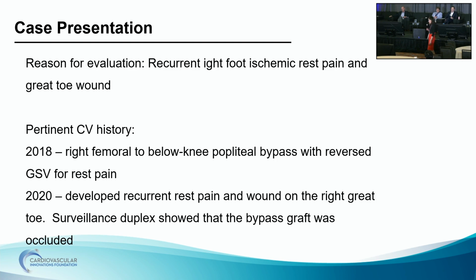I decided to do a Penumbra thrombectomy, but in the end, you could still see the problem, which was the messed up distal. Actually, the distal aspect of the vein graft I think had been balloon angioplastied so many times and was severely scarred, and that I think led to everything failing recurrently. You know, on a lot of these IVUS, when you do IVUS of these anastomotic lesions, they're neointimal hyperplasia and pretty aggressive.